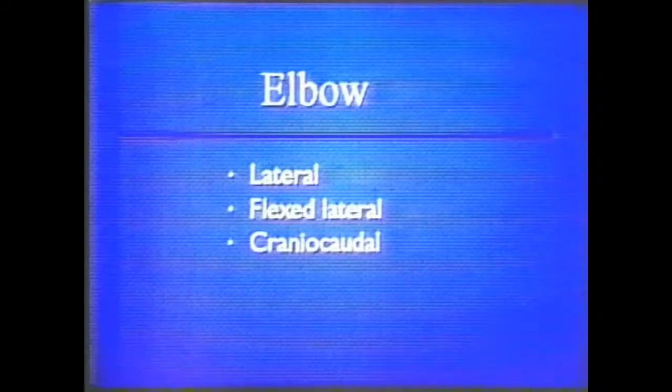This shows a less stressful position for obtaining a tabletop caudal cranial view of the shoulder or humerus. Notice the cassette is propped up and the beam is angled to hit the cassette perpendicular. This less stressful technique is important in post-op radiography.